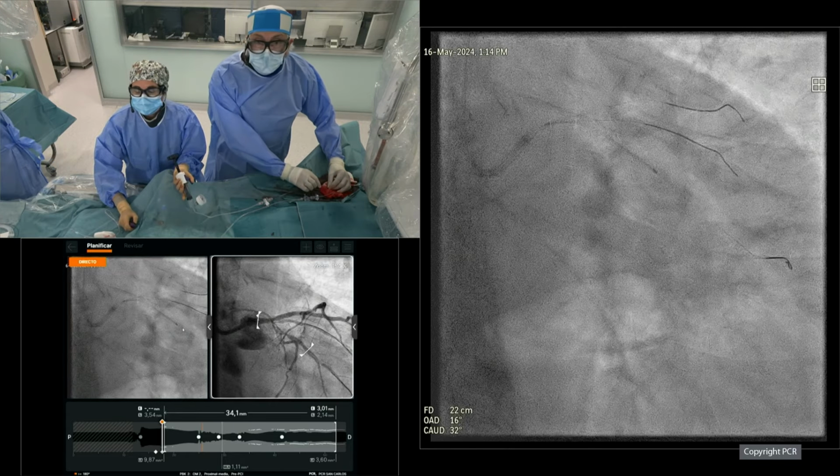I think that's right. I'd probably take a 4.0, but I wouldn't be too concerned. They've obviously made a good choice in the stent. So what is the next step? We're doing POT with a 4.0 balloon. And you leave the wires in place, still jailed? Of course. We're going to leave them in place.